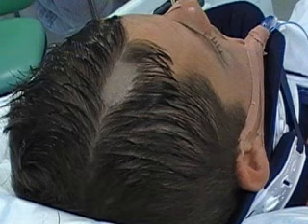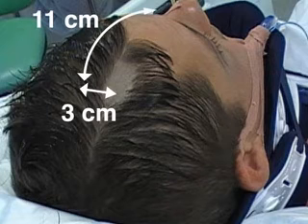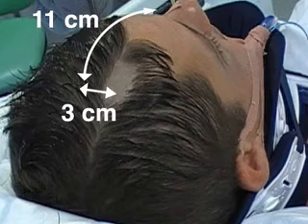The incision is made along the mid-pupillary line, 3 cm lateral to the midline to avoid the sagittal sinus, approximately 11 cm posterior to the nasion, and at least 1 cm anterior to the coronal suture to avoid the motor strip.